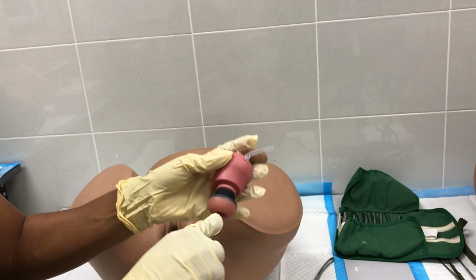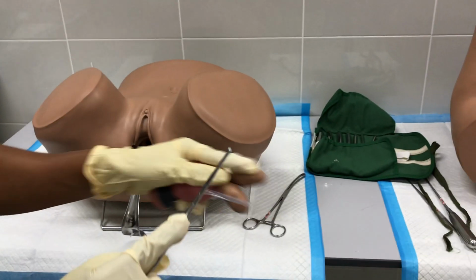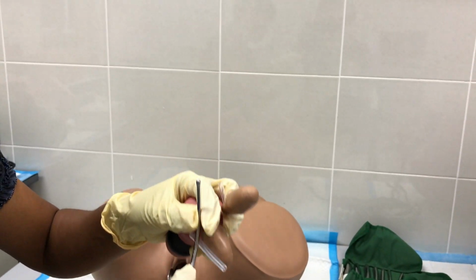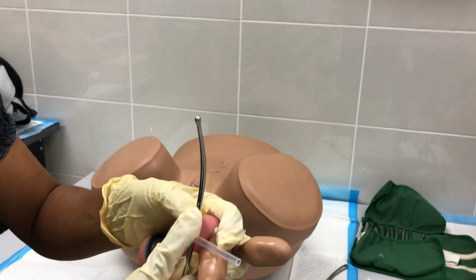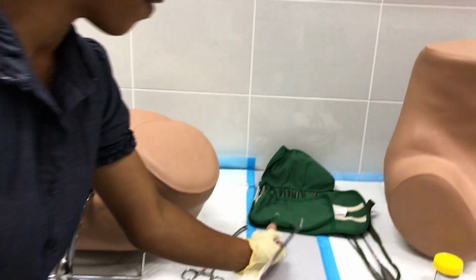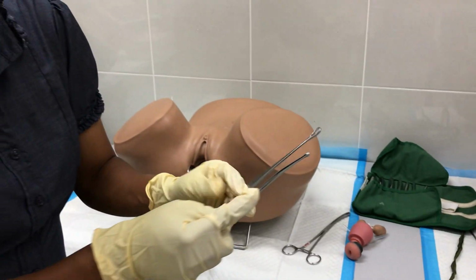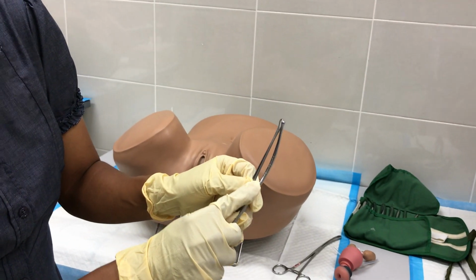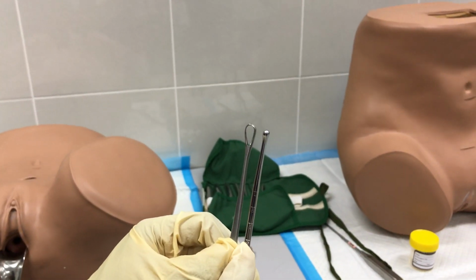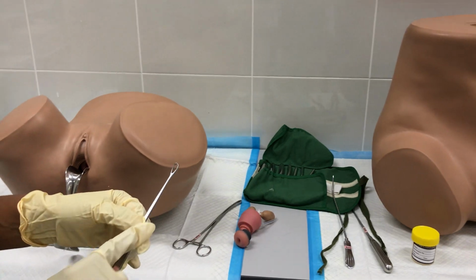So the moment you hit there, okay, that is your uterus size. So you know already, you cannot put any instrument beyond this length. So this is your number 7, so 7 centimeter. This is the 7 centimeter uterus size, uterus length. So after this, whichever the procedure, whichever the instrument you use, you need to make sure this is the length. This is the length of the uterus, so you cannot go more than that. Okay. So after that, you can use this.